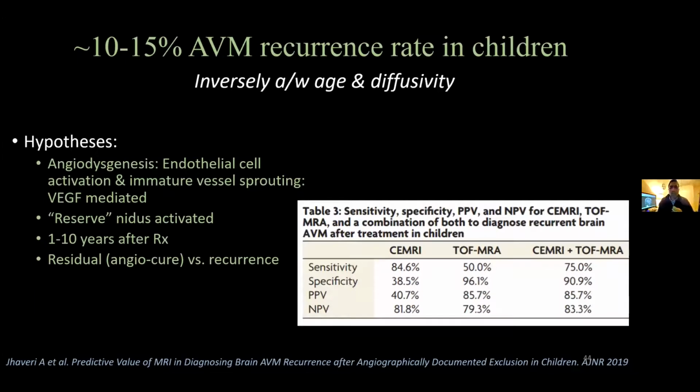So last time we looked at our MRI to look at the sensitivity and specificity of these contrast-enhanced MRI and time-of-flight techniques.